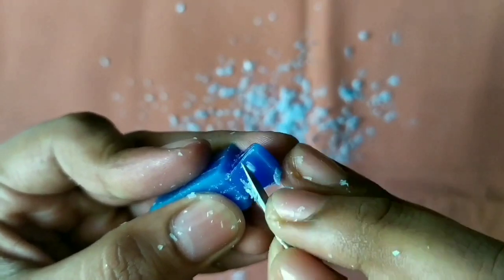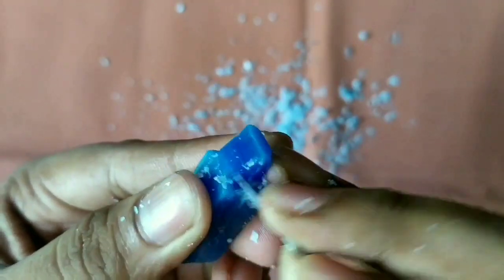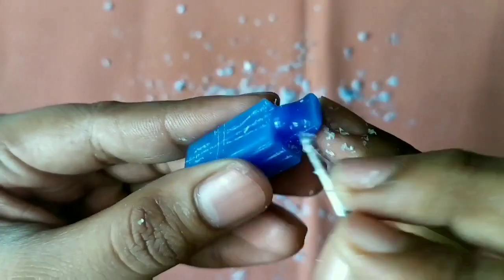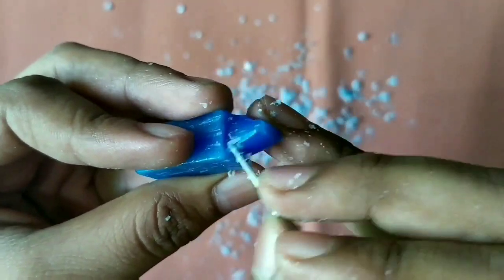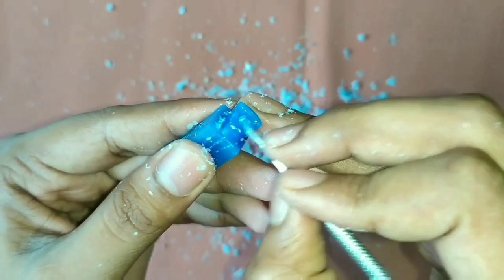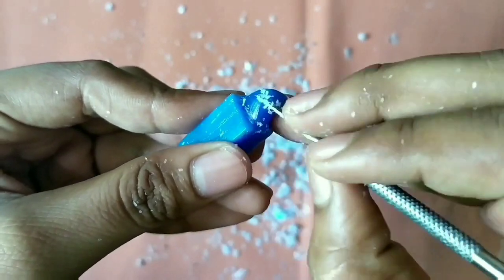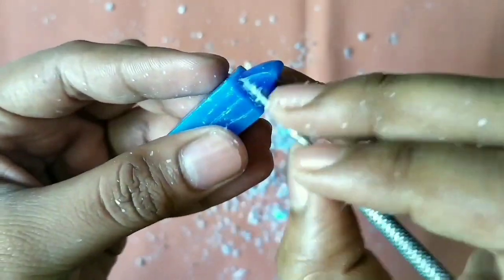Start removing the edges so that the cingulum becomes prominent. Carefully remove the excess wax and make the cingulum properly. It is triangular in shape.